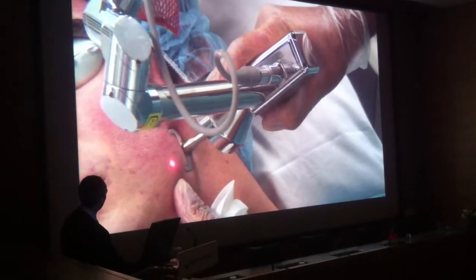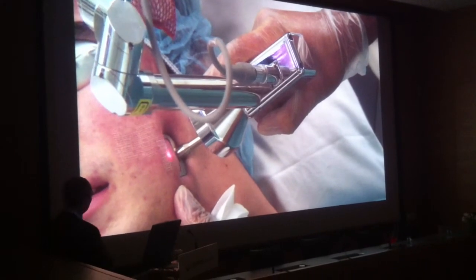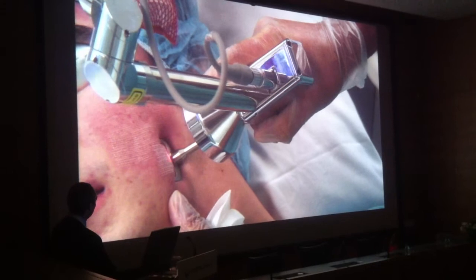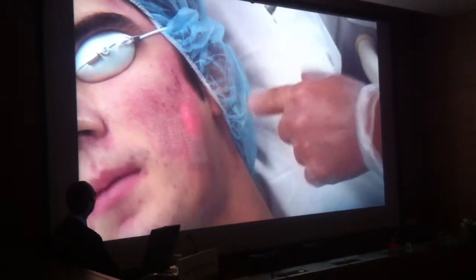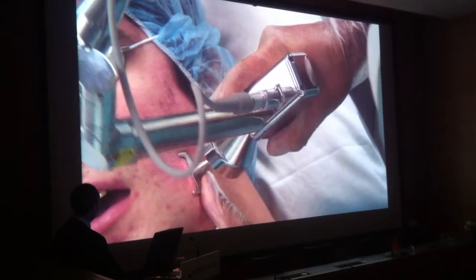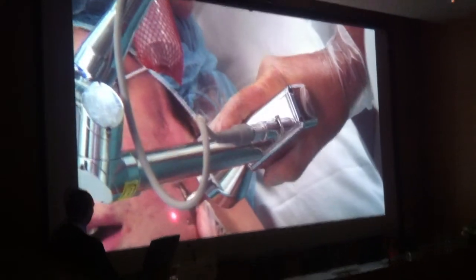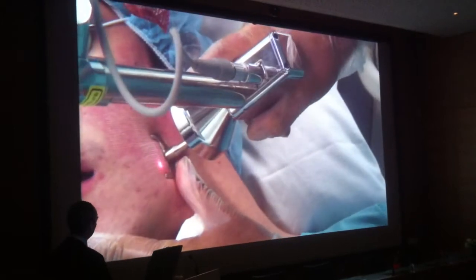Okay, one question here from the room, if you can hear me, is whether it would be better to do subcision of these scars. That's definitely one way to deal with them. However, subcision of a fresh evolving lesion, I don't know how safe that is. On the contrary, I prefer to do two other things, which are more regenerative and less mutilating.